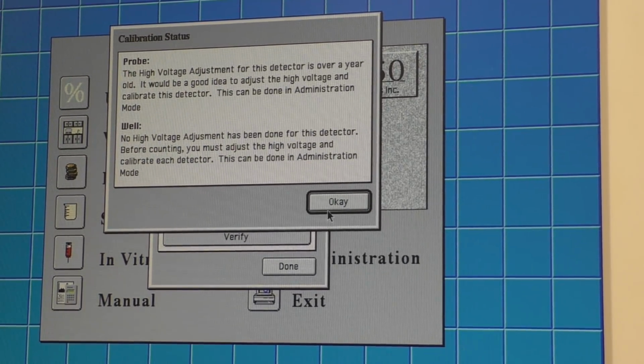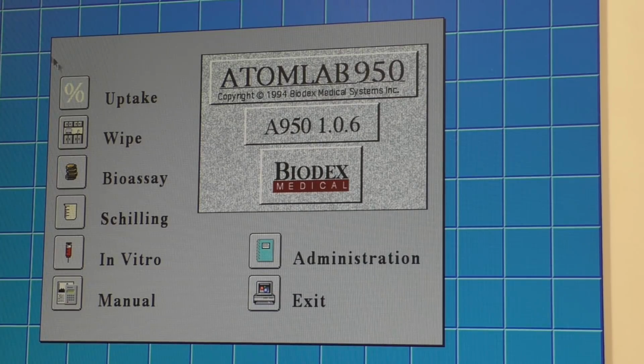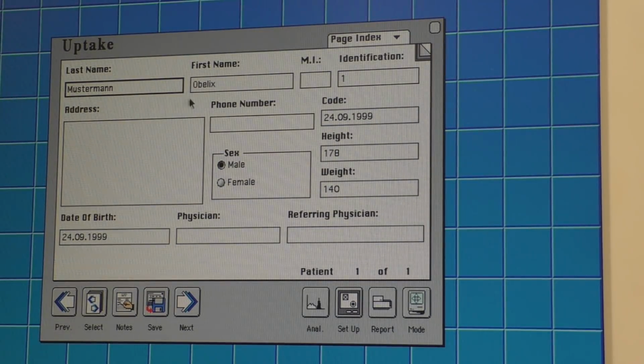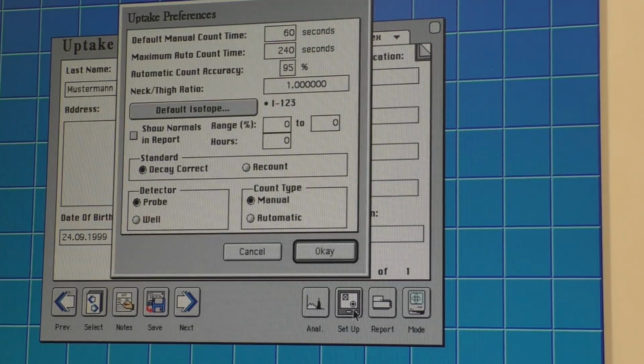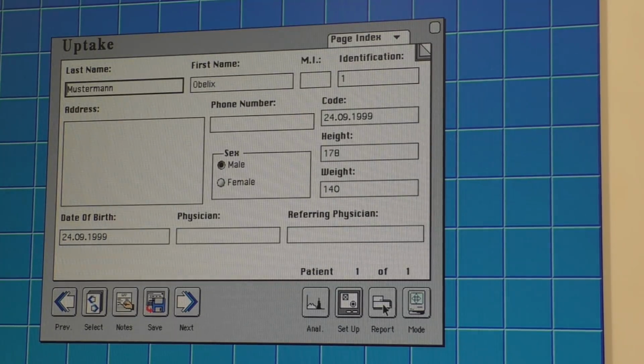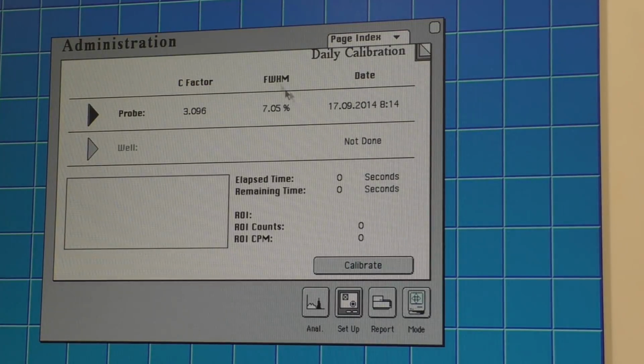Okay. Verification, okay. Let's try this one. Okay, that's a template patient analyze. Okay, we didn't set up. Okay. We can print a report. What did I want? Administration, maybe. We have to calibrate this thing because it has not been calibrated. Well, the last time was 2014.